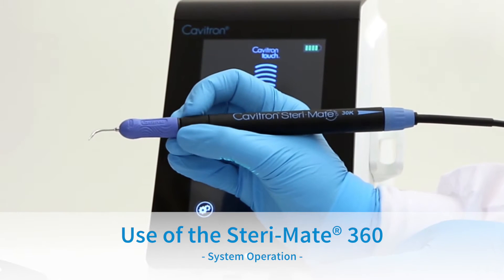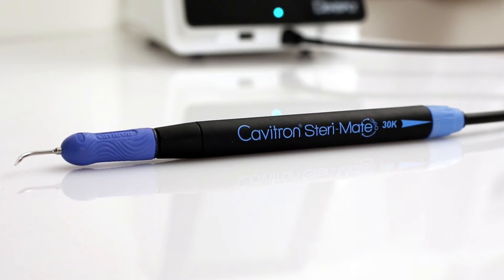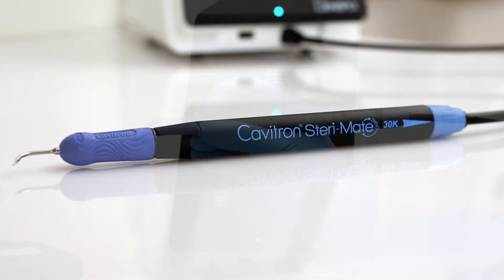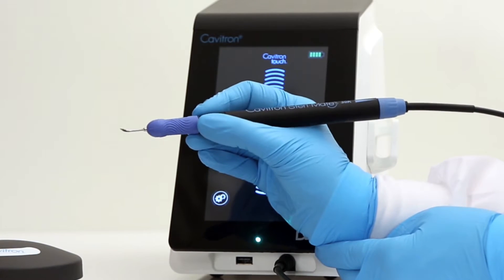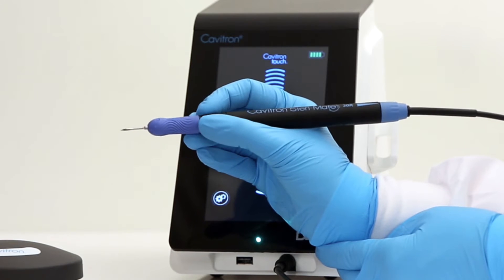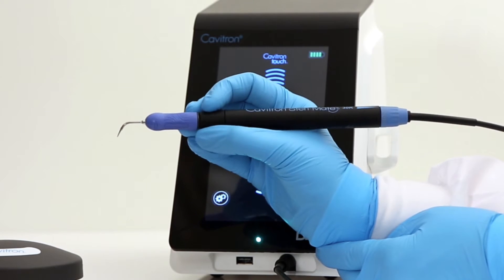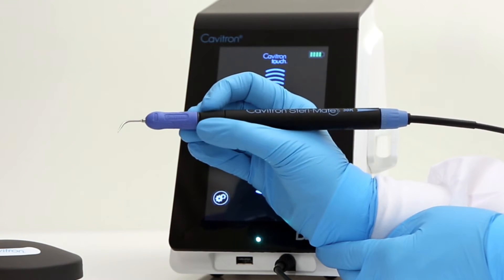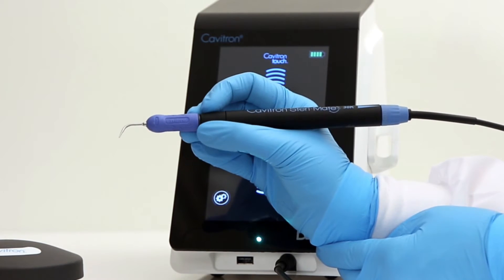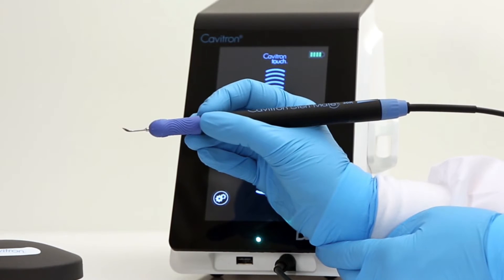Use of the SteriMate 360. The exclusive SteriMate 360 swivel handpiece allows the clinician to fully rotate and insert, and also allows adjustable hand positioning with free-flowing movement, providing ergonomic benefits. The SteriMate 360 provides the clinician with access within the entire oral cavity. To rotate the ultrasonic insert, place fingers on the nose of the handpiece and rotate to your desired position.